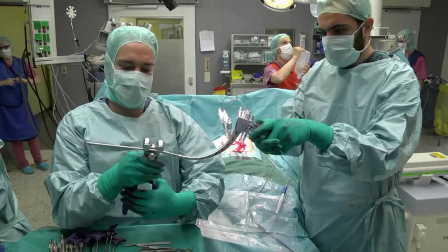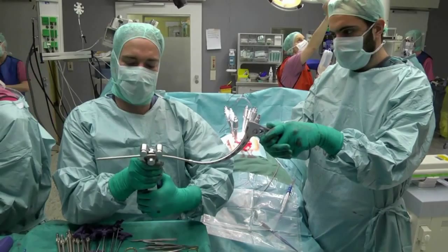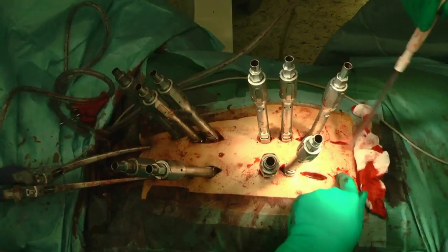After measuring, the length of the rods is determined. Screw loosening was discovered at L1 after inserting the left side rod. As the screw cannot be replaced, stabilization is extended to L2. The rods are then inserted in cranio-caudal direction and fixed to the screws. The wound is then closed.